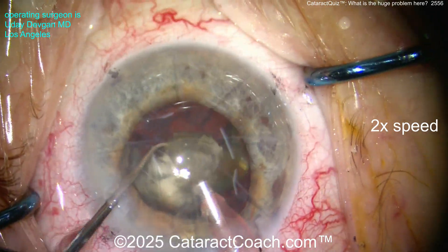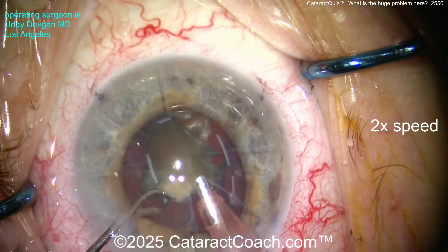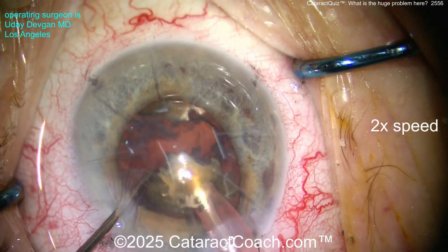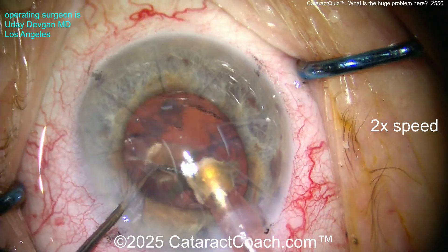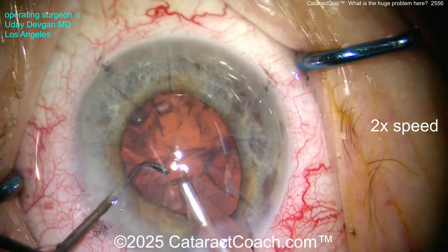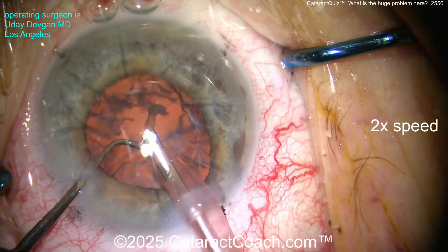The nucleus comes up pretty easily. We're doing a little bit more chopping here to break this fragment into smaller pieces, and these can all be aspirated pretty easily. Watch carefully again — everything looks so good so far. Getting out that last bit of nucleus, looks pretty clean.